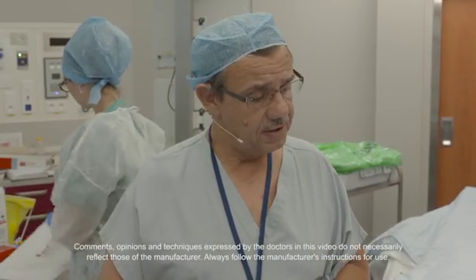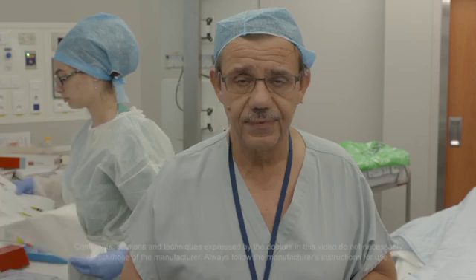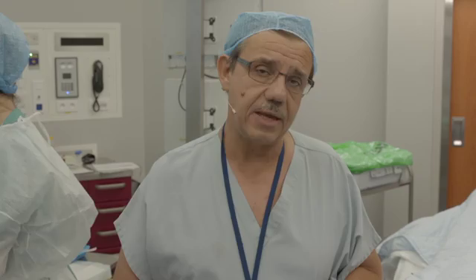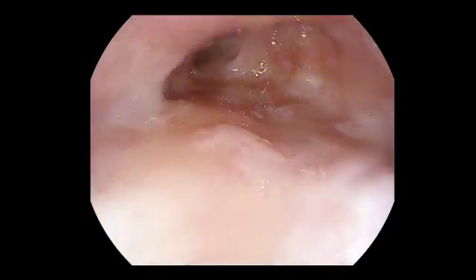This is a patient of 57 years old who has a Barrett esophagus with high-grade dysplasia on the biopsy. The goal of the procedure is to do the endoscopic resection using the DUET system for the resection of this high-grade dysplasia Barrett esophagus.